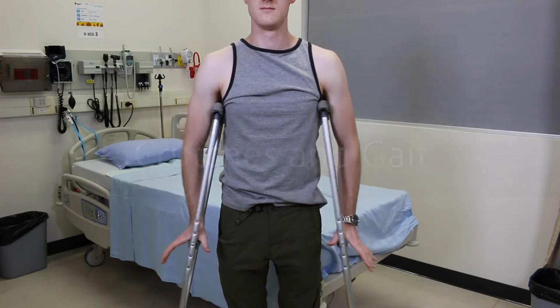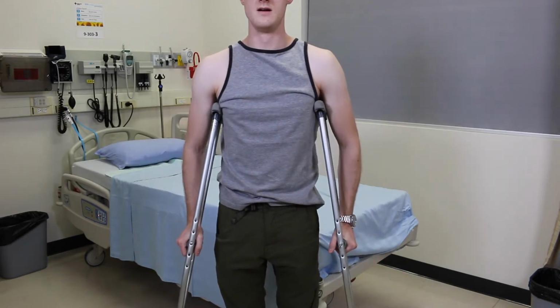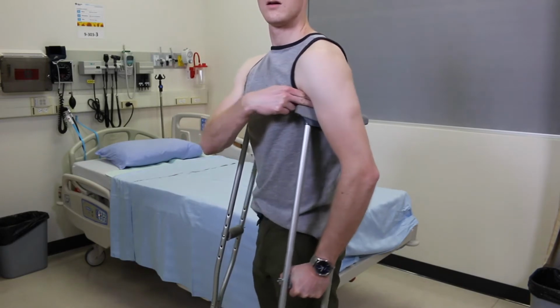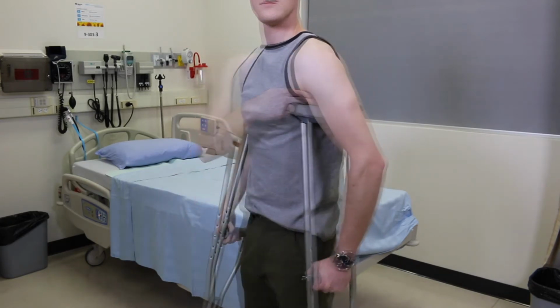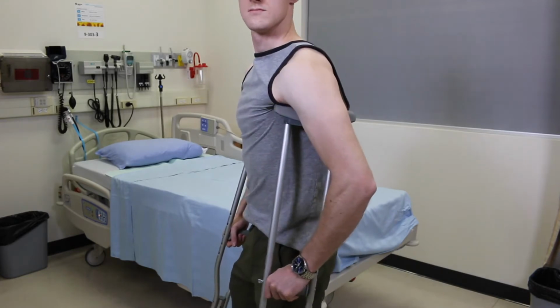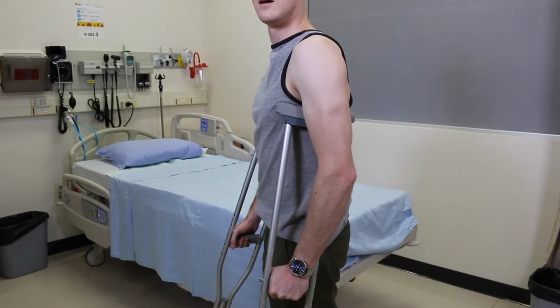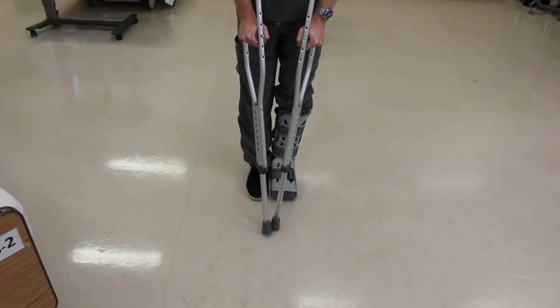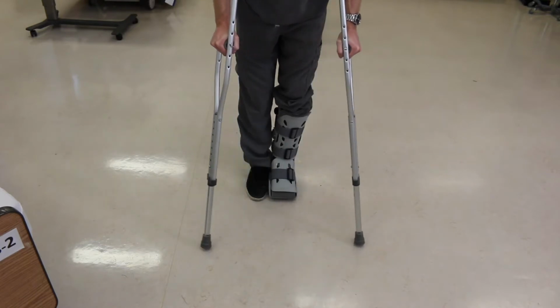When using crutches, you need to put the weight onto the palms with a 2 to 3 finger width gap from the top pad to the armpit. Do not have the arm straight or a large bend in the elbow. There should only be a slight bend. You should have the crutch tips a little more than shoulder width apart.